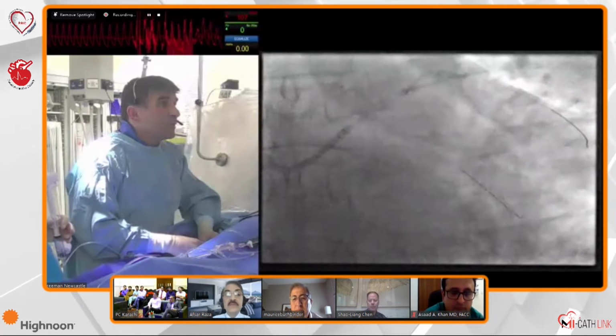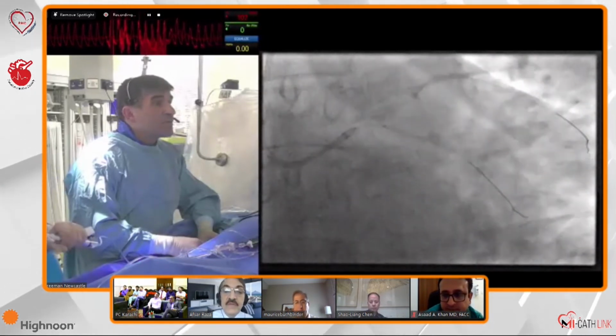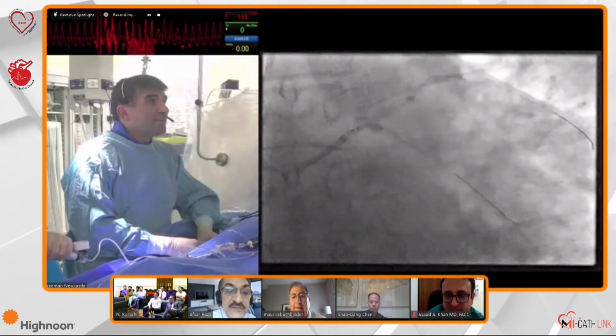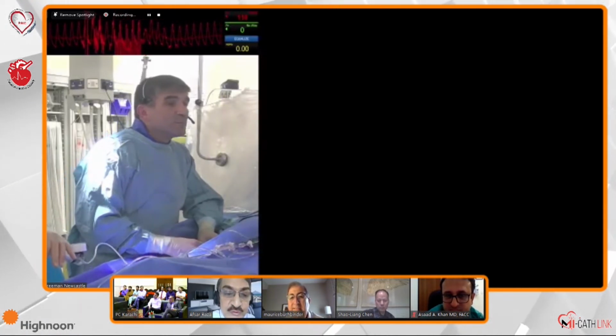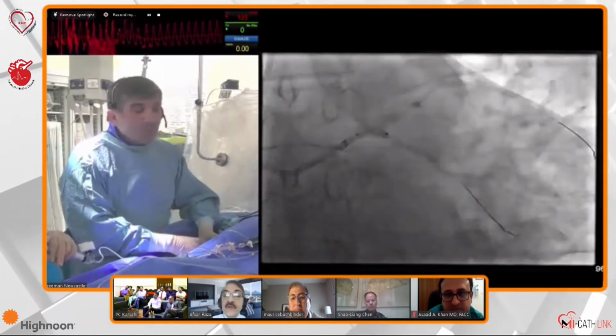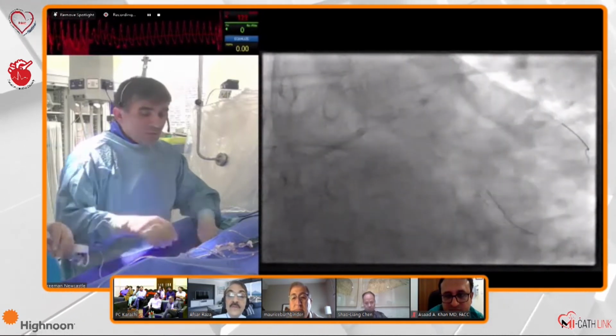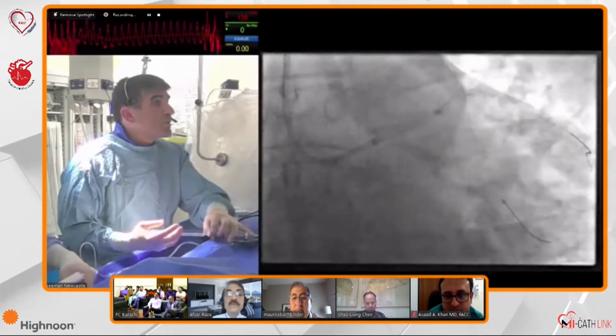I've got no problem. Of course, here you go. Just go up there to 8 atmospheres. We can squeeze 5 minutes more to do an IVUS if you want. As you can see, it's expanding, but we could come down. We could IVUS it. I've got no issue, none whatsoever. It's easy to do, and just make a little test here, make sure all is present and correct.